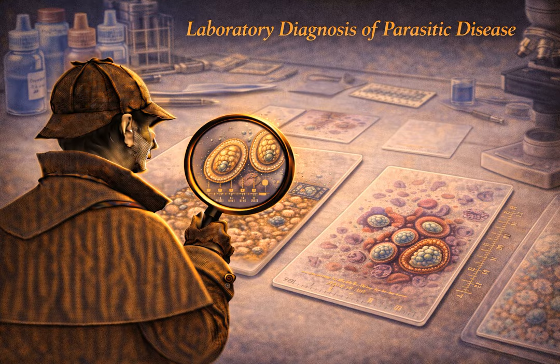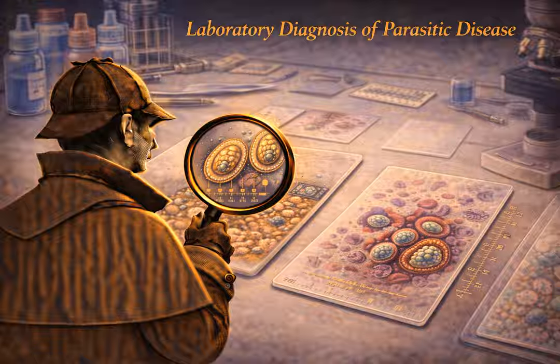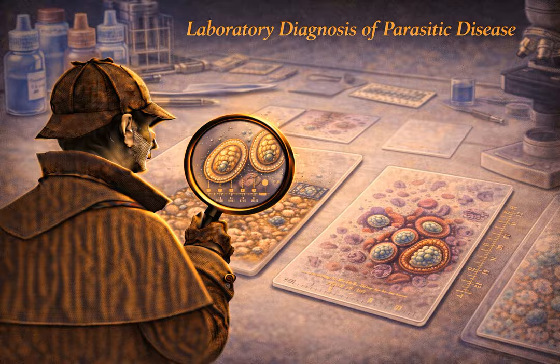Let's bring in Jawitz here to really visualize some of these bad guys. If I am the tech looking down the scope, what are my mental anchors? Let's take Giardia lamblia first. Giardia is totally iconic. It's the poster child. In the wet mount, the trophozoite exhibits what is classically described as falling leaf motility. Falling leaf. Yeah, it doesn't swim forward in a straight line. It sort of tumbles and flutters side to side, exactly like a leaf slowly falling from a tree branch.